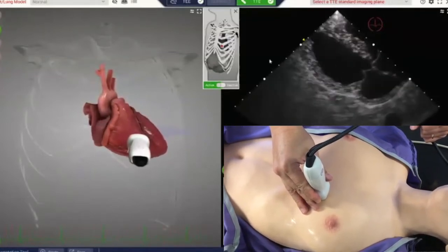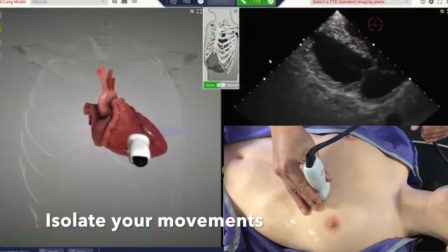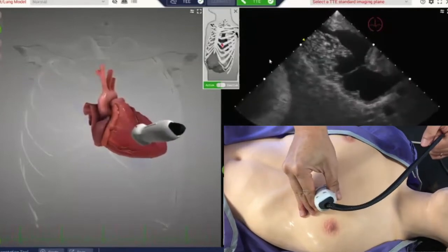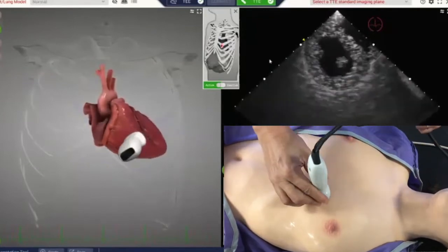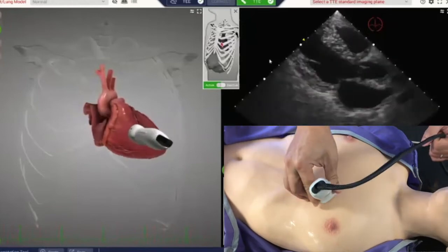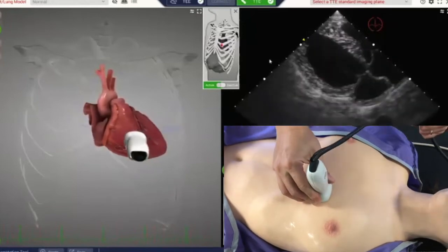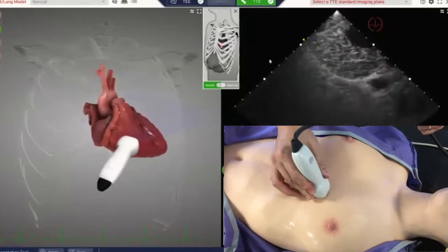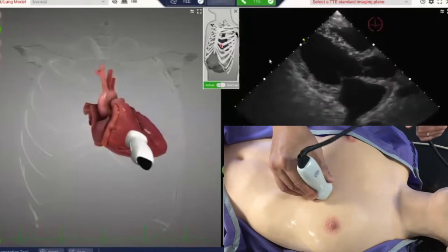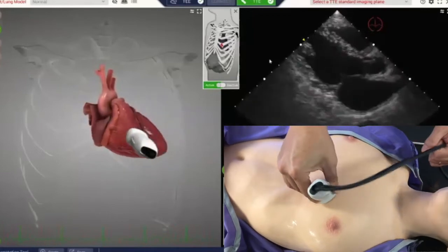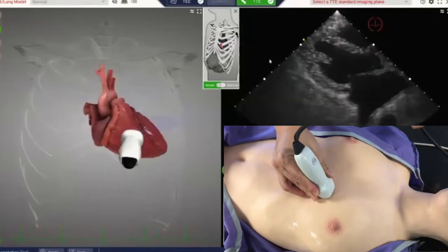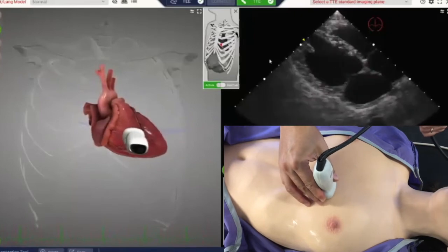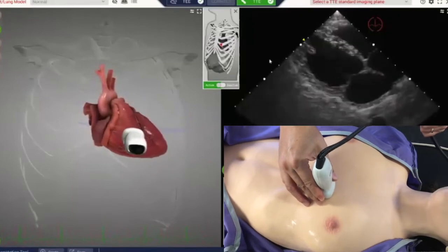You want to be able to isolate your movements — do one movement at a time. For example, when you rotate, you don't want to angle as well. Or when you're fanning, you don't want to angle. You want to appreciate how your movements translate into changes in the image, and you can only do that by isolating your movements.